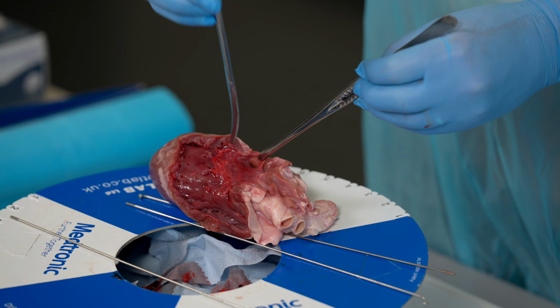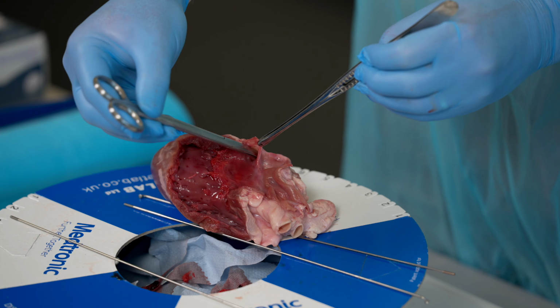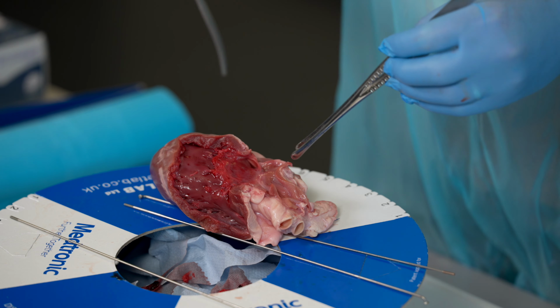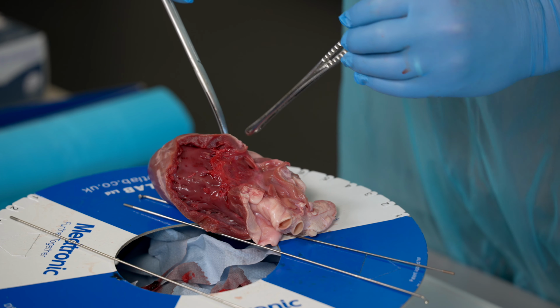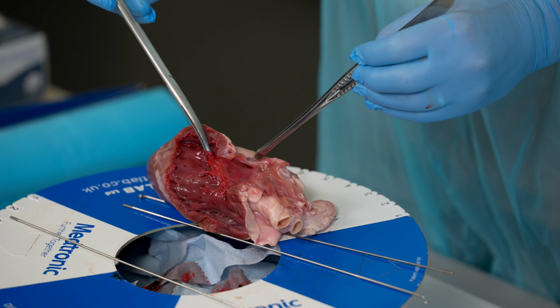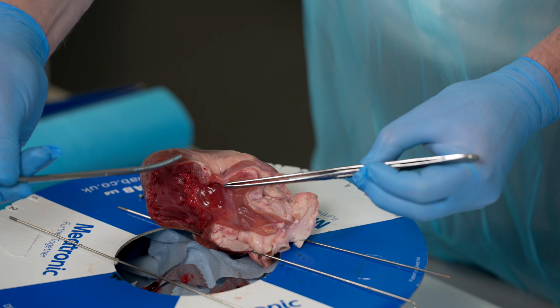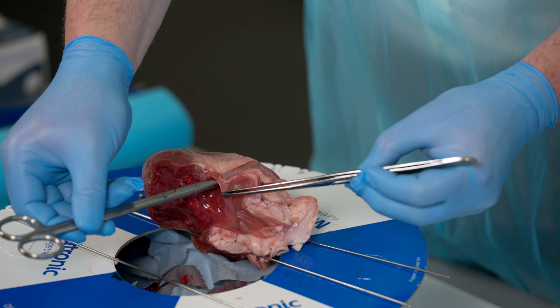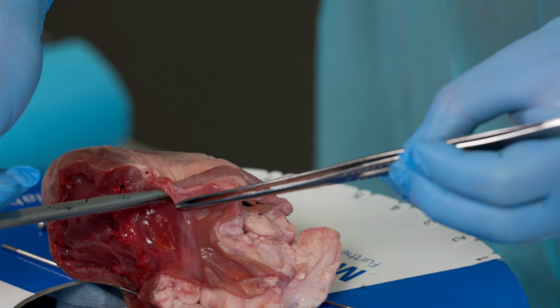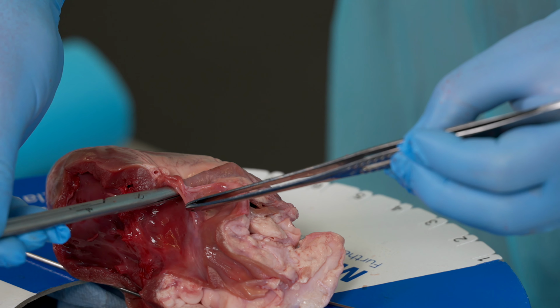And a cannula is placed into the coronary sinus, and it has a balloon which expands so as to allow the blood to be perfused retrogradely without leaking back into the right atrium. But what you'll notice is that the coronary sinus has got a funnel-shaped orifice, and that funnel shape is continued for perhaps 2 centimeters into the structure, and thereafter it becomes tubular. You can see my instrument passing into the coronary sinus here. So if the balloon is where the tip of my scissors is, it will be good. It will work very nicely.